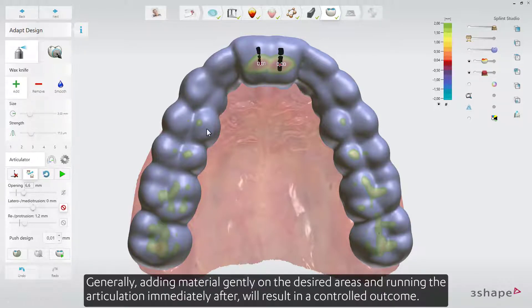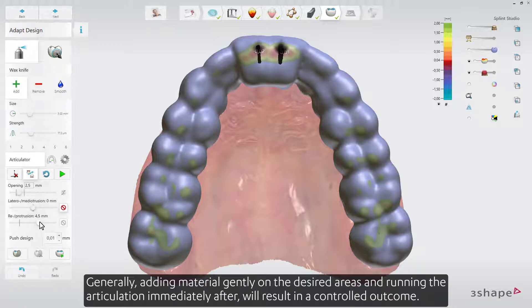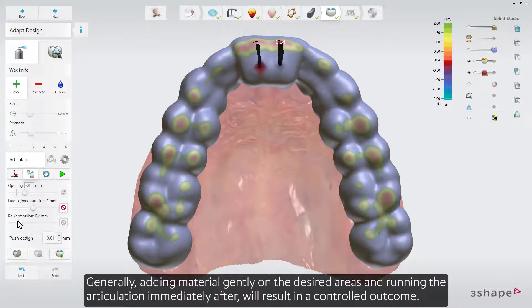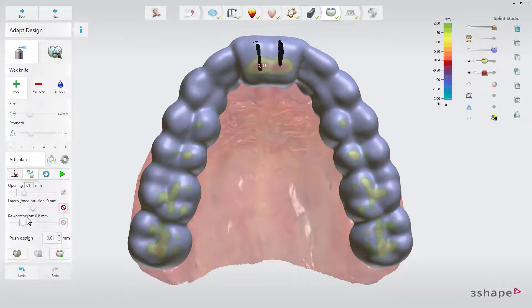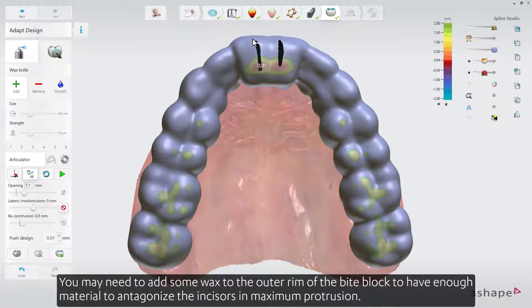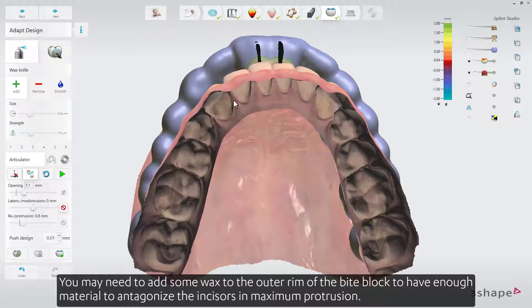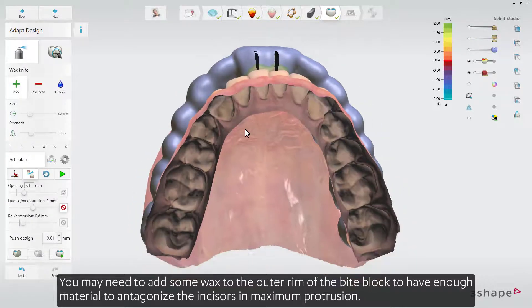Generally, adding material gently on the desired areas and running the articulation immediately after will result in a controlled outcome. You may also need to add some wax to the outer rim of the bite block to have enough material to antagonize the incisors in maximum protrusion.